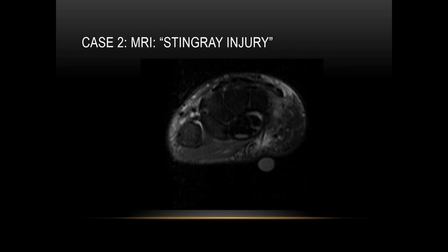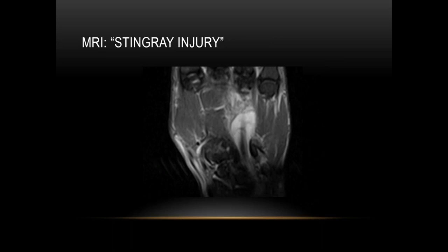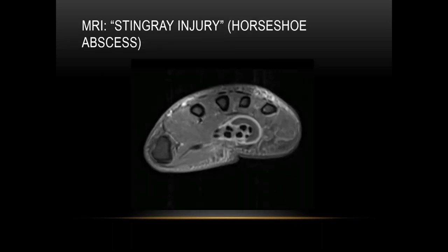This patient had a stingray injury. An axial image with a skin marker overlying the volar aspect of the wrist and anterior to the flexor retinaculum shows a linear low signal intensity foreign body — the stingray barb. A coronal image further demonstrates the barb, and a post-contrast axial image shows this foreign body was associated with a horseshoe abscess in the region of the extensor — excuse me, flexor — retinaculum surrounding the flexor tendons.